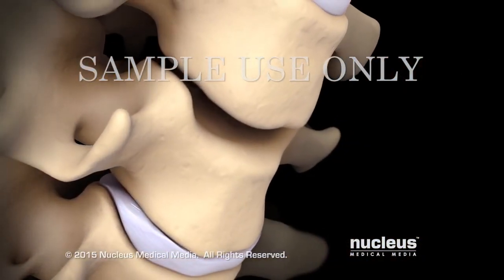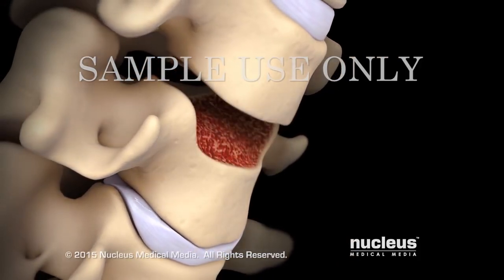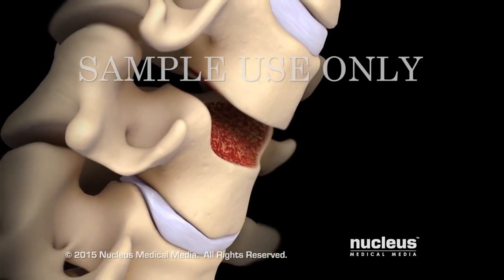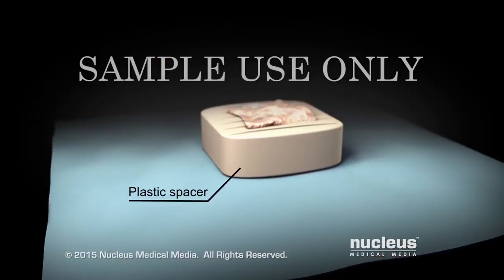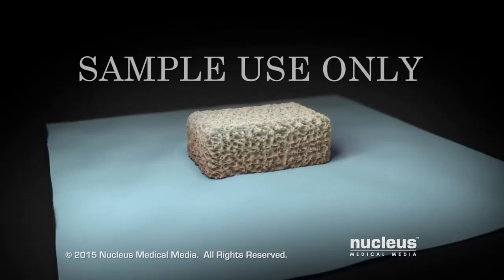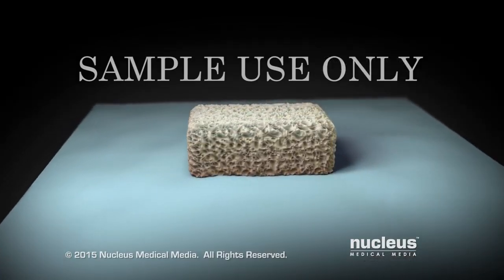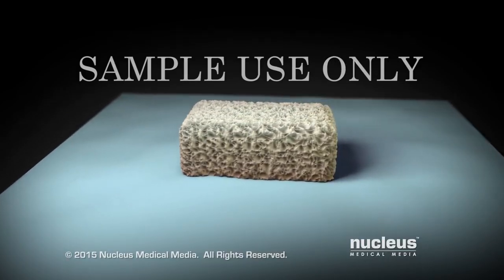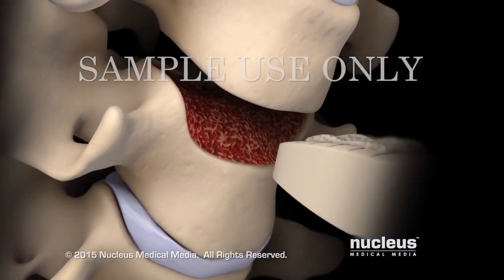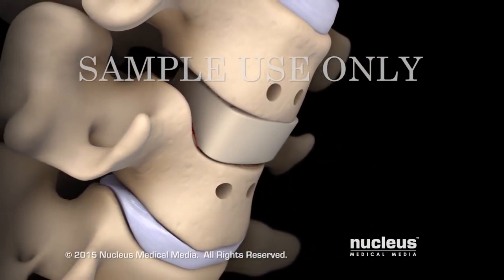The vertebral bodies above and below the removed disc will be trimmed to allow placement of a bone graft. Your surgeon may use a plastic spacer filled with synthetic bone graft, or bone graft may be taken from another donor before your procedure. The bone graft will be placed between the 2 prepared vertebrae, allowing them to fuse together.